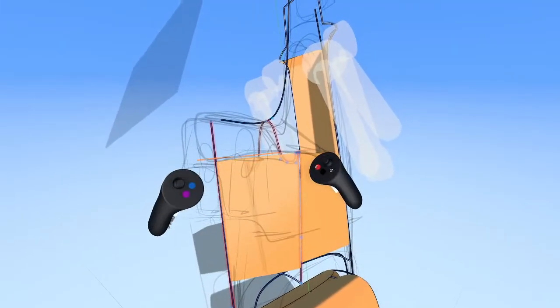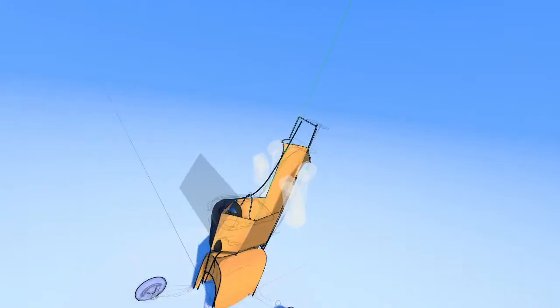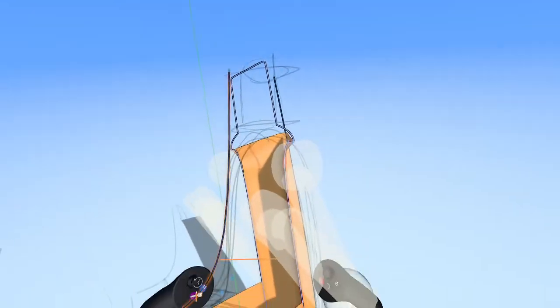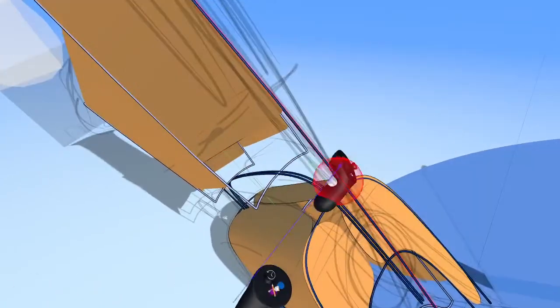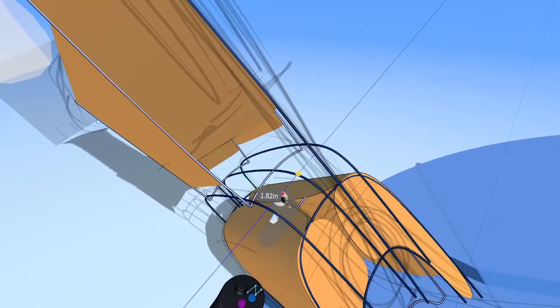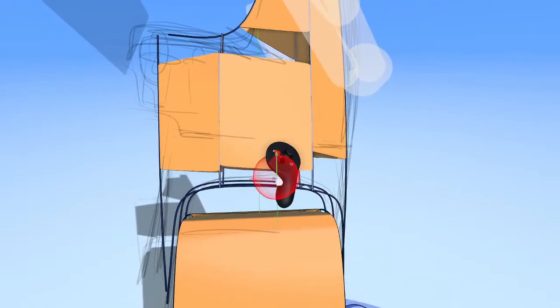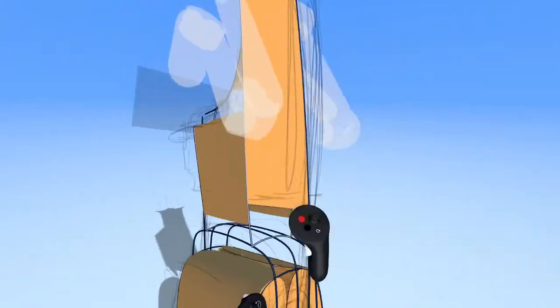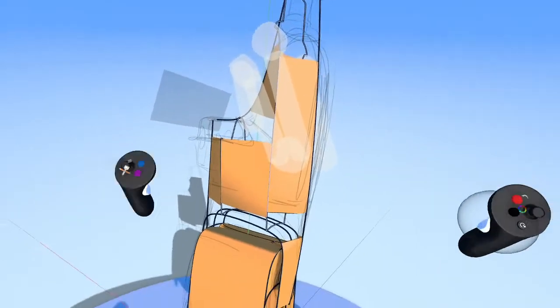And then one here. Okay, so what we just did isn't really surfacing, right? It's just sort of piecing together things. But I'll show you how you can take separate surfaces like this and start connecting them together and creating the form. And actually, I'm just noticing if we duplicate this line out like that and lower it to match our side view there, it's going to be a lot easier for us to make surfaces. So now I'm going to just create one here and then create one here. Okay, good.